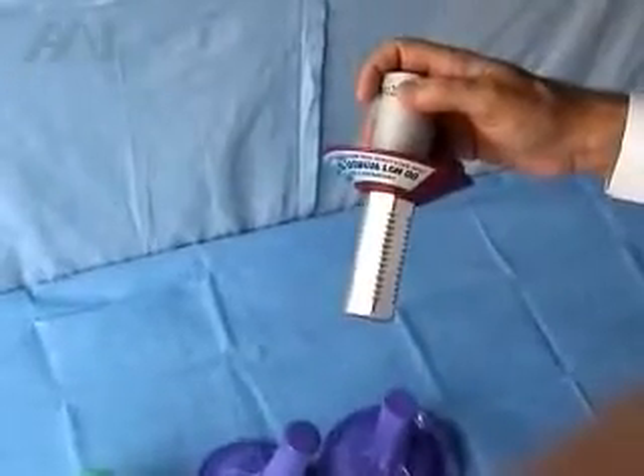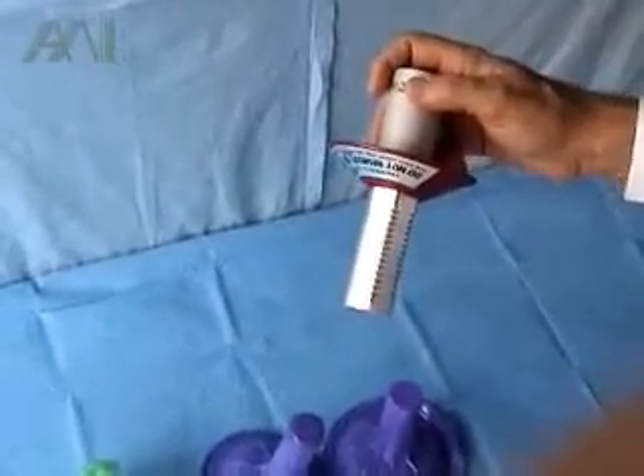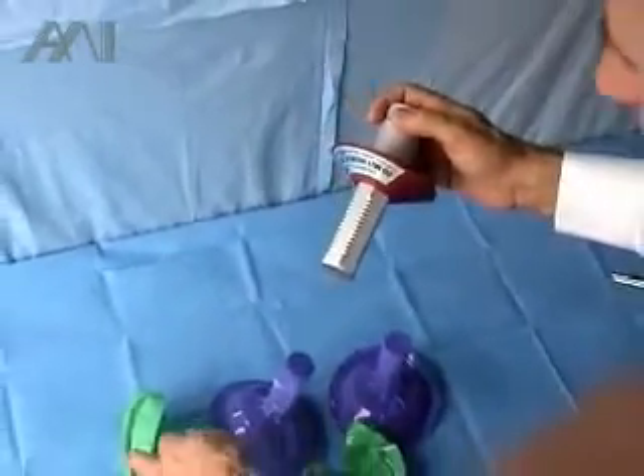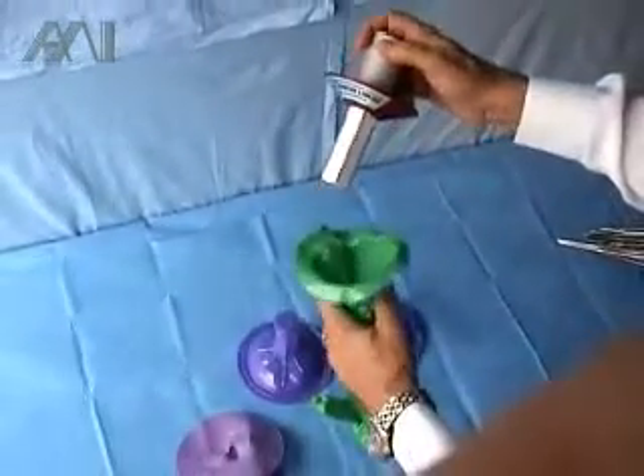I would like to explain to you our new light handle cover and the advantages over existing disposable light handle covers.